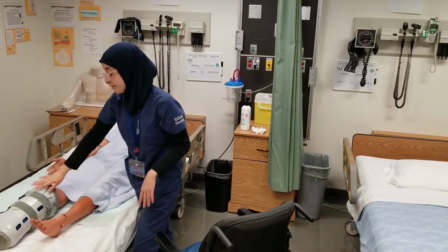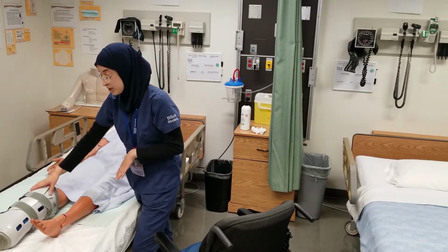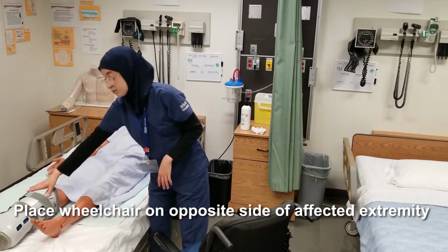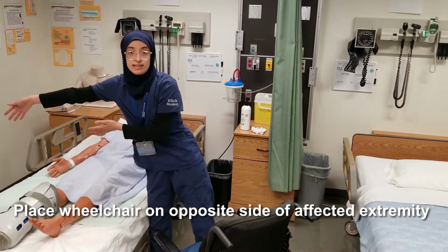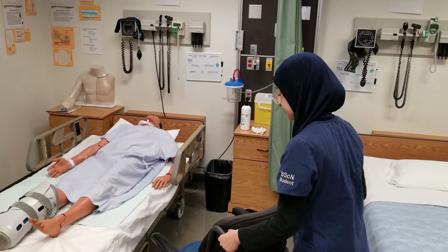All right, and now that I've confirmed that my injured or weak leg is the right leg, I want to make sure that my wheelchair is going to go on the opposite side. So if it's the right leg, it's going to go on this side. If it's the left leg, it's going to go on that side. All right, so I'm going to grab my wheelchair.